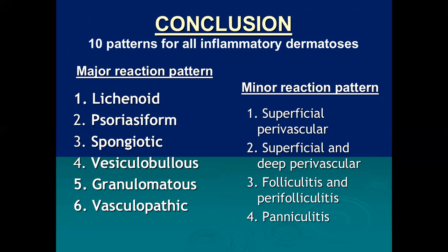Similarly, granulomatous, vesiculobullous, or vasculopathic. So if you are able to classify your inflammatory skin condition into any of these patterns, then the final diagnosis or the definite diagnosis of that histology becomes very, very easy.